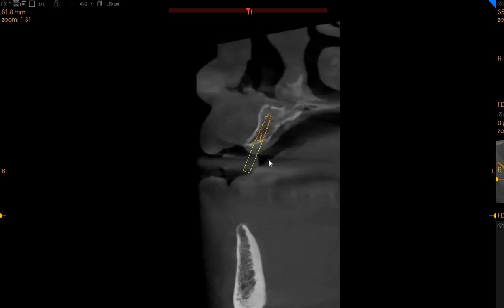This is the lateral and central region. As you can see, we have to go in slightly deeper with 5 millimeters of ridge width and approximately 10 millimeters of height.